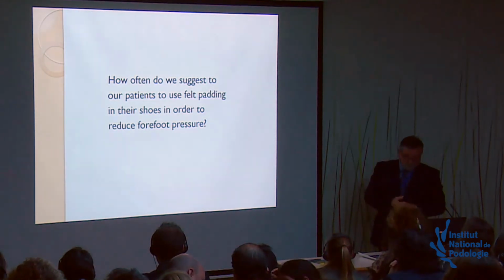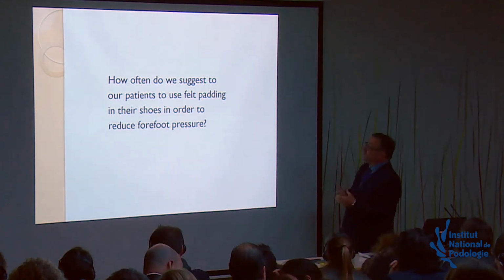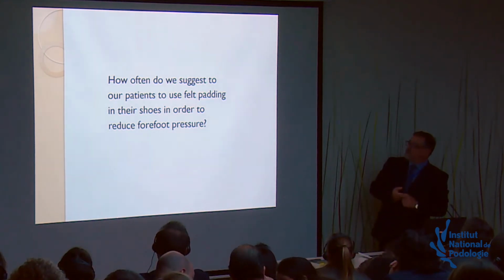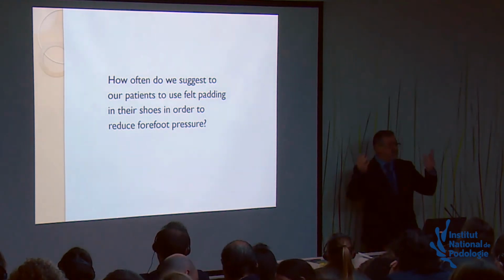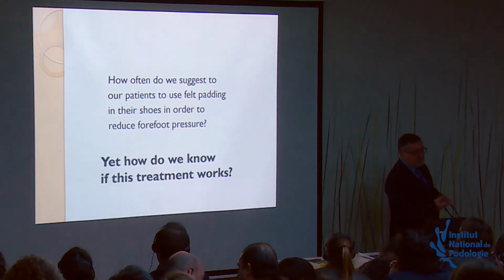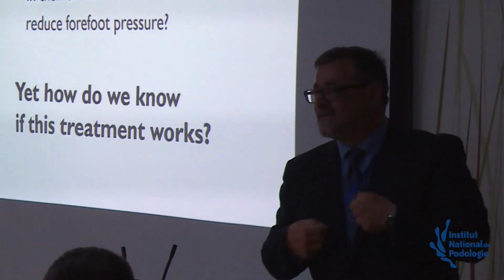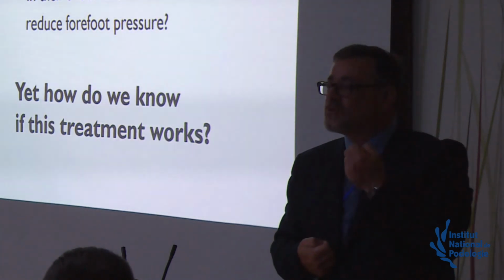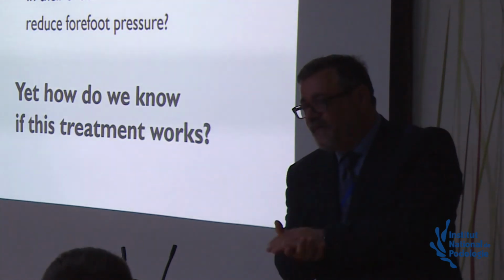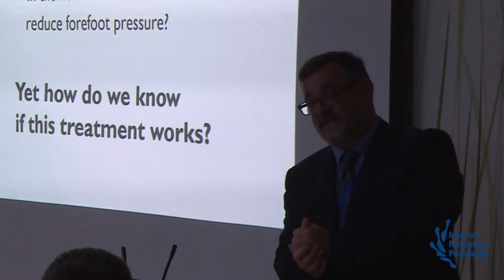So, basically, just like to close with this: how often do we suggest to our patients to use felt padding in their shoes in order to reduce forefoot pressure? We use that a lot. But how do we know if this treatment actually works? Unless we use systems that help us to objectively measure, in this case, vertical pressure, for example, an in-shoe system.